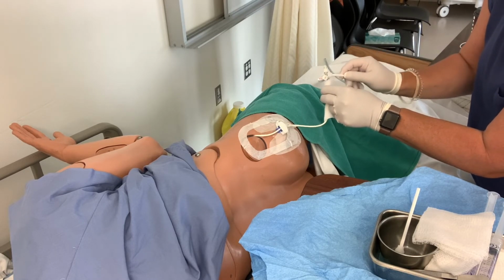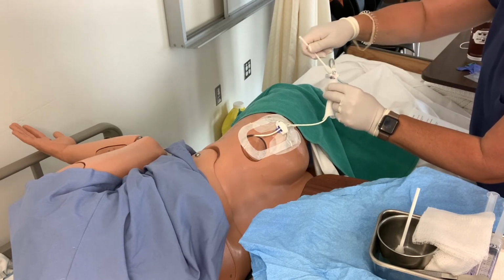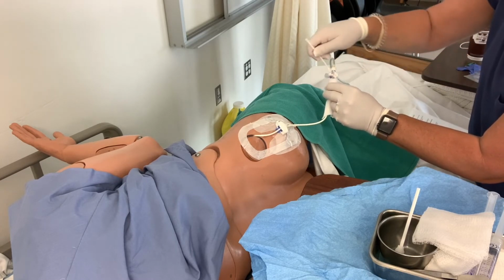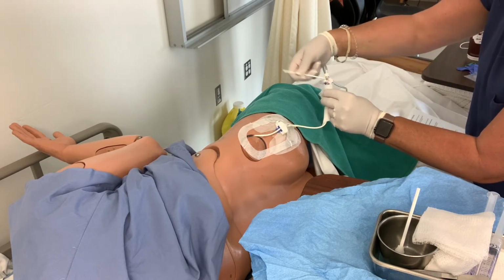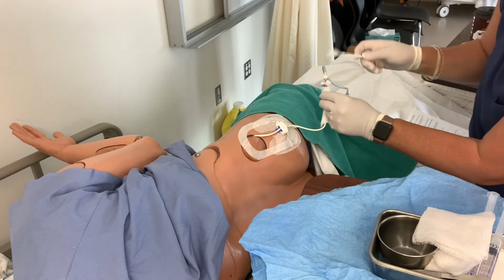So again, I'm going to take the chlorhexidine swab stick, and we never take off the stopcock. The stopcock always stays with the patient. Okay, so I'm going to go around that, around the disconnection port. And I'm going to discard that one, and I'll do it again.